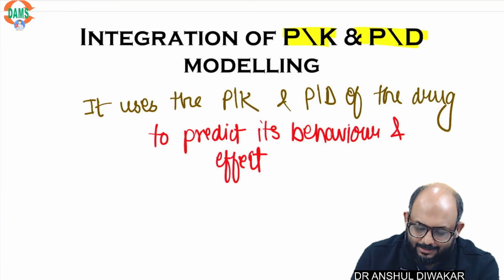It integrates the pharmacokinetics of a drug, that is what the body does to the drug, with the pharmacodynamics of the drug, what the drug does to the body, to predict its behavior and effect. This is the integration that TCI does.